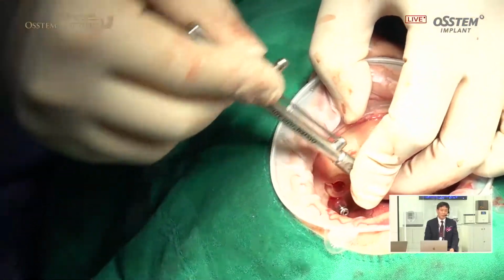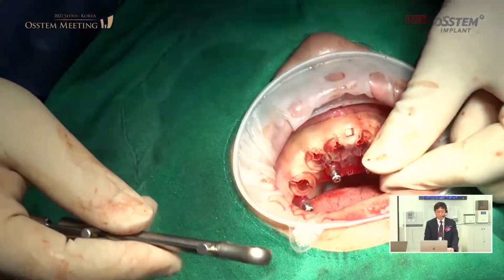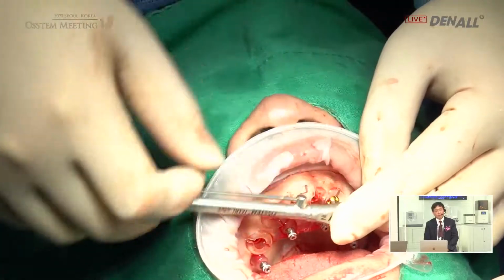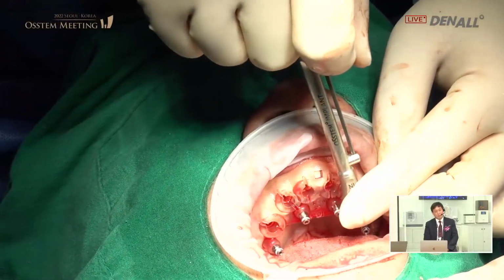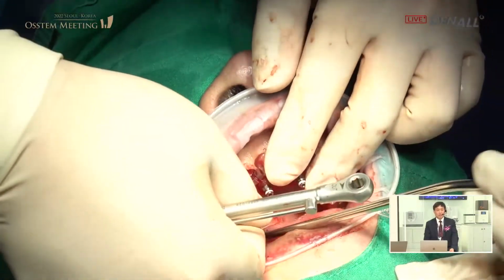It's 30 Newton centimeter. Number 23. About the 30 Newton centimeter. Four implants in the anterior. Initial stability, primary stability looks good.